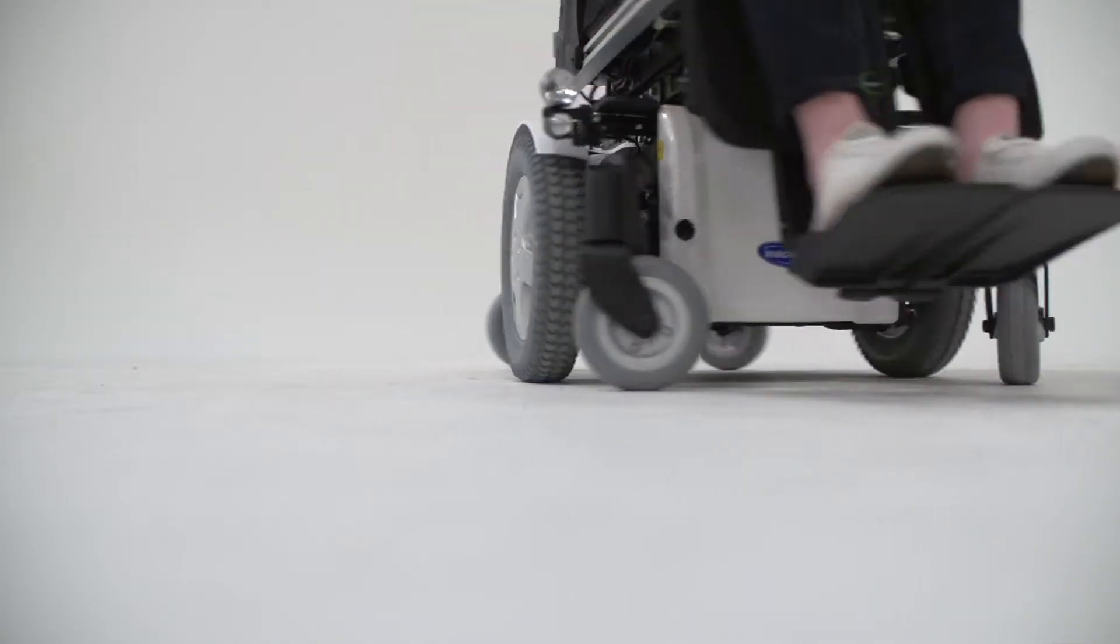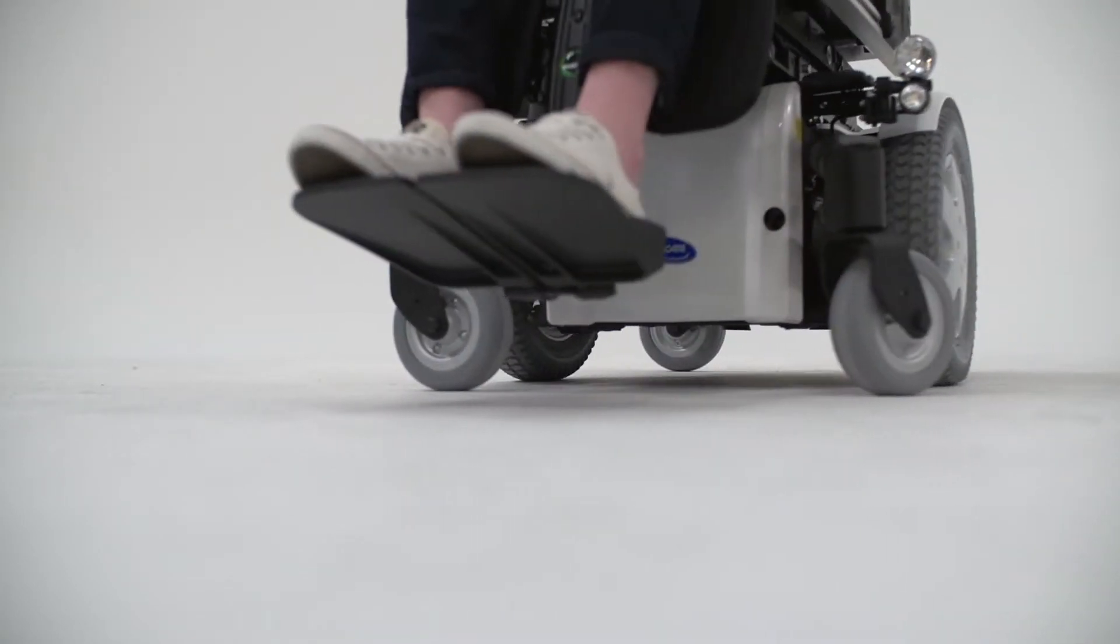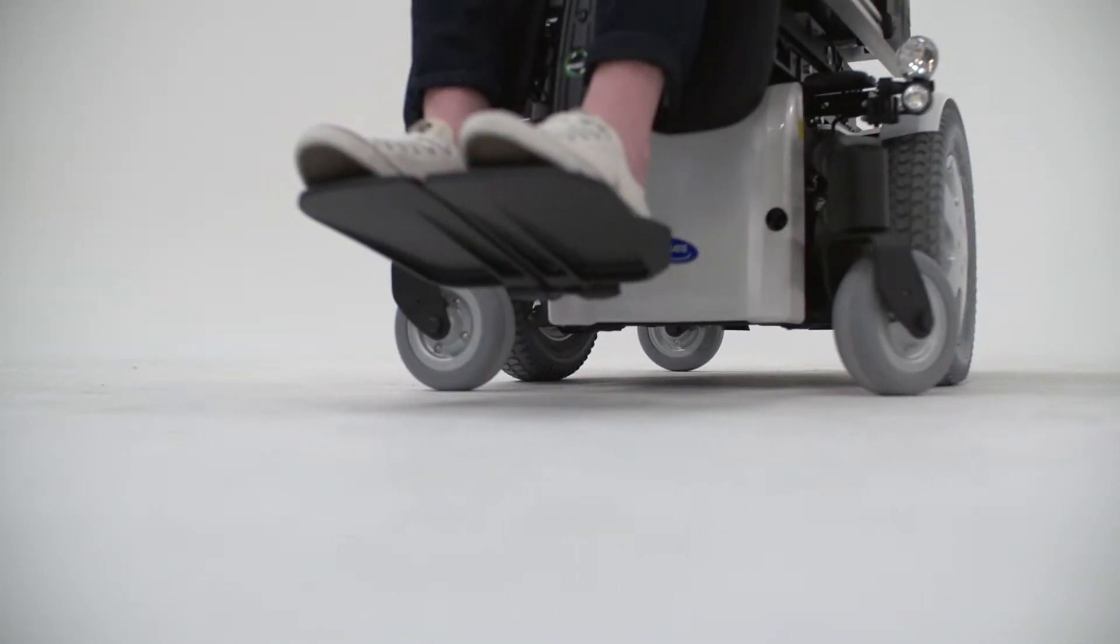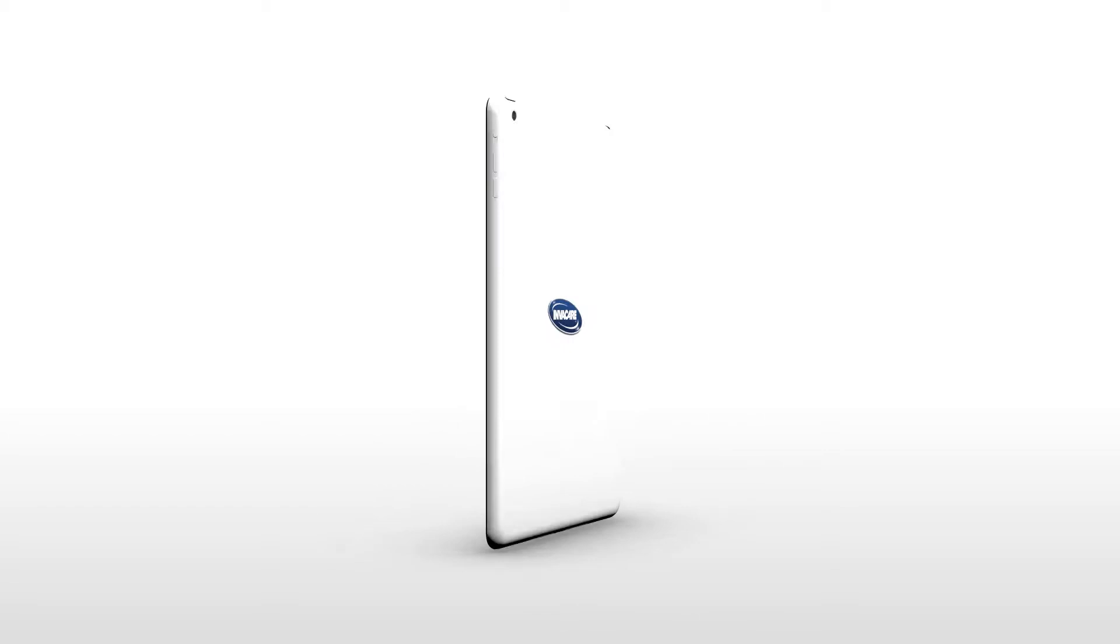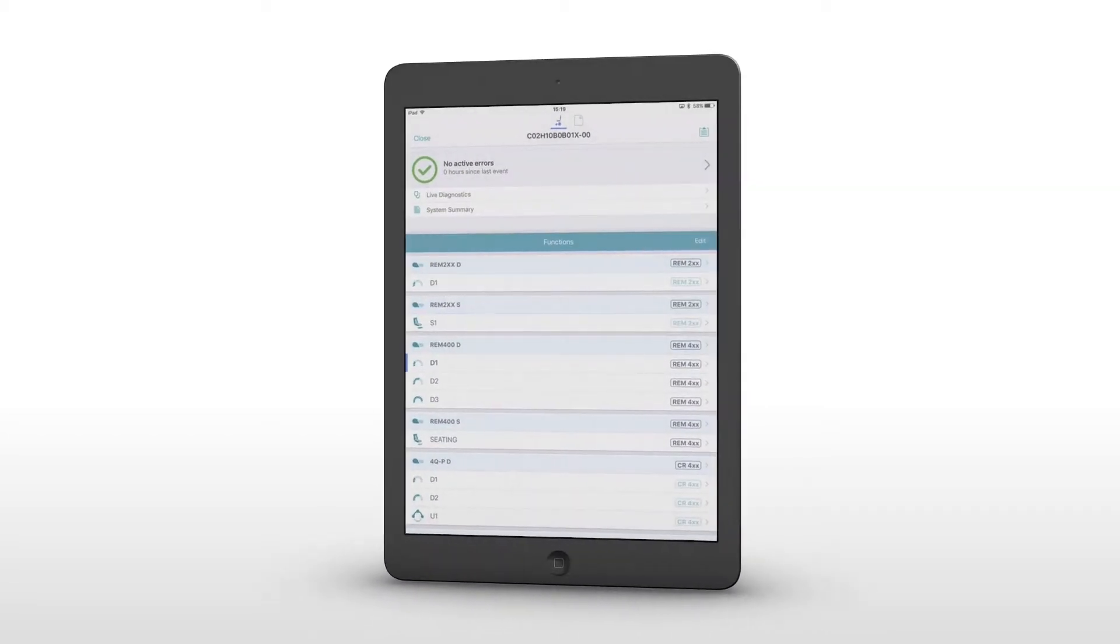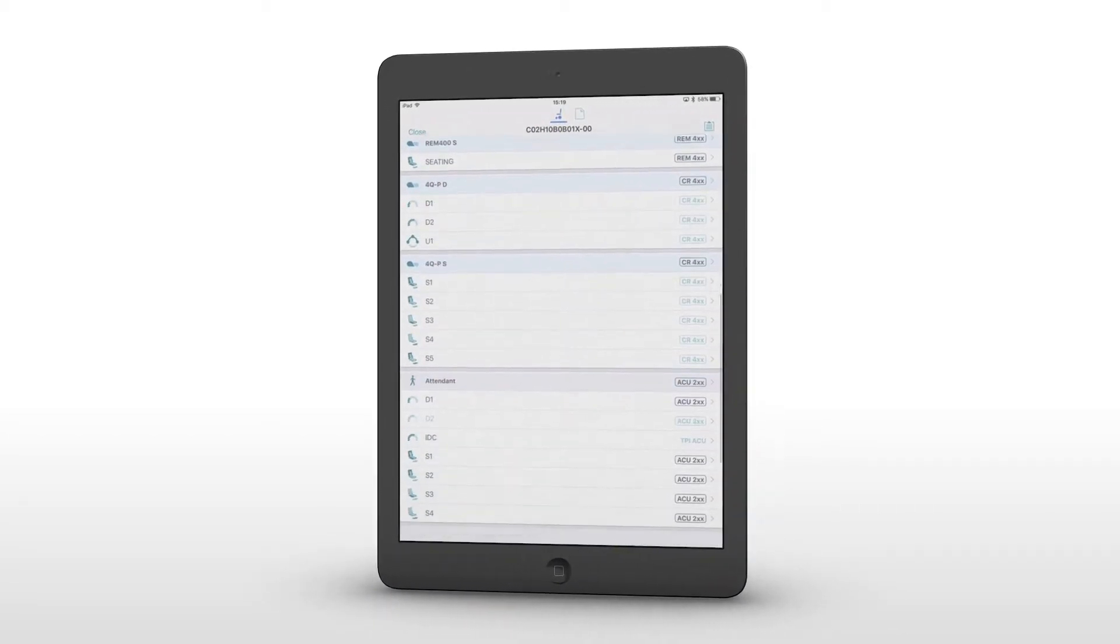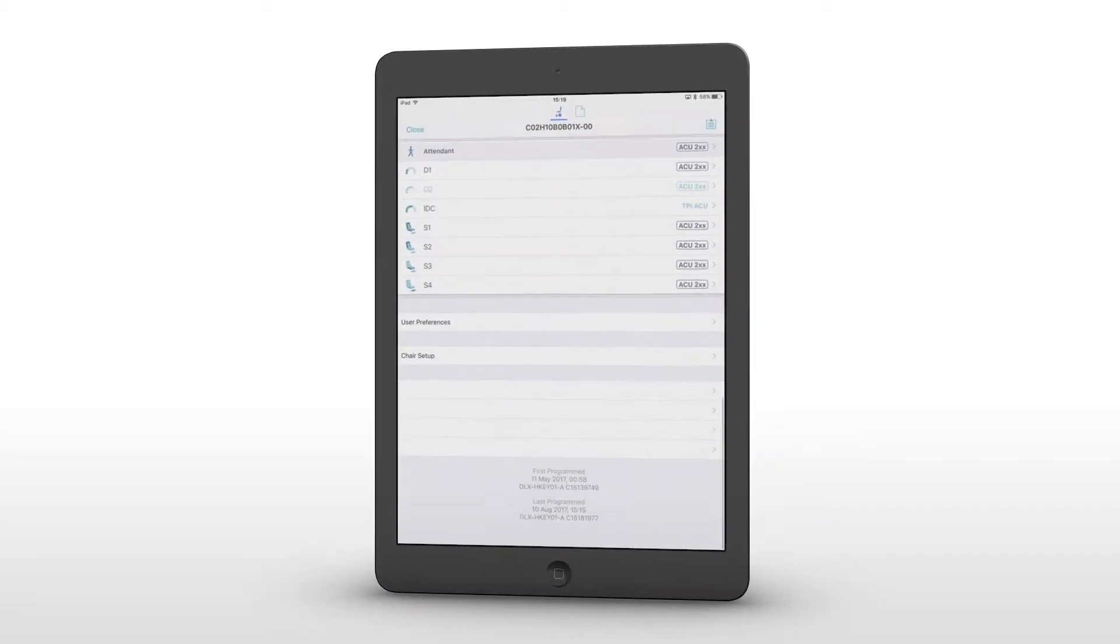To access the adaptive load compensation calibration, the PC or iOS device must be connected to the power chair.